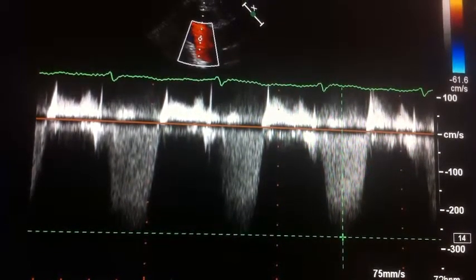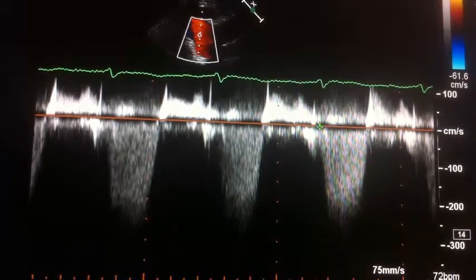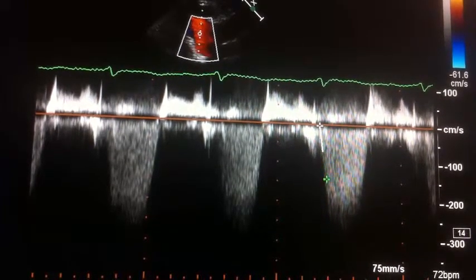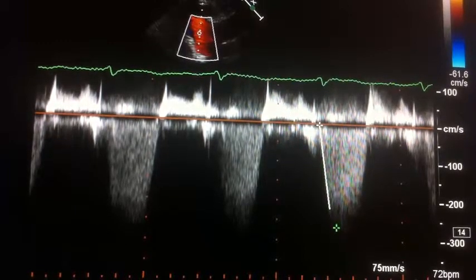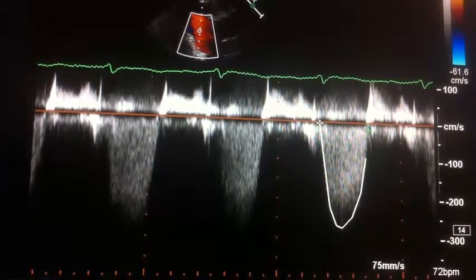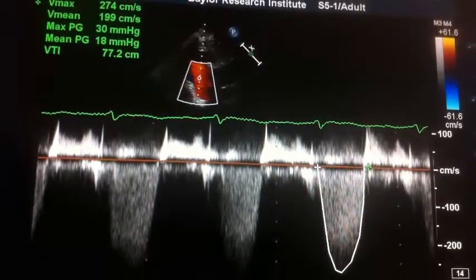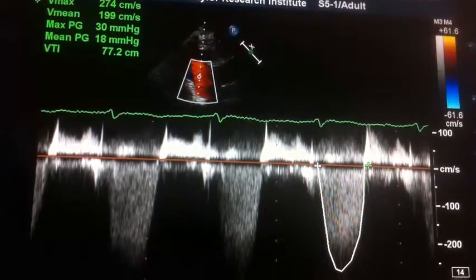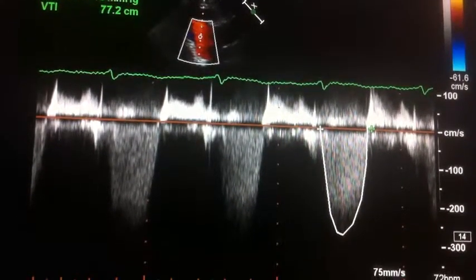Another thing we might do is actually trace this velocity profile. I would start here and trace around it, and from this we would get a velocity time integral — the velocity and the time under this curve. It gives us a VTI, which we can see up off to the left, of 77.2. From this we can calculate valve areas and things of that sort.